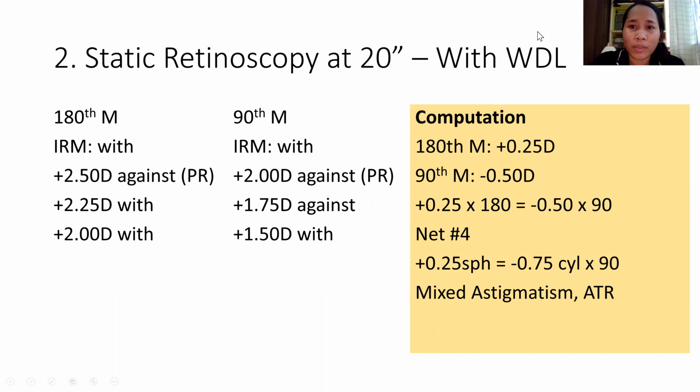This is the with WDL. So some of you are still confused on the with and without WDL. So let me review first before I go through the case. When we say with WDL, the IRM is plano, right? IRM, you do it with plano. And in neutralization, in with WDL, you will start neutralizing at the working distance lens.